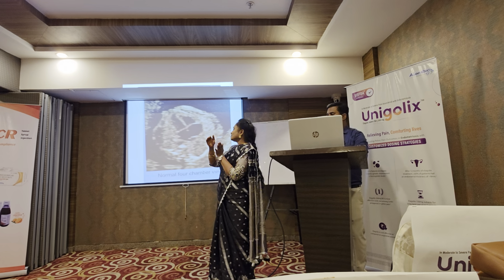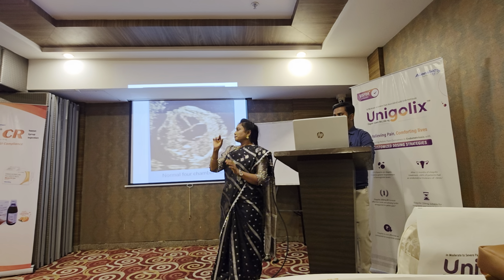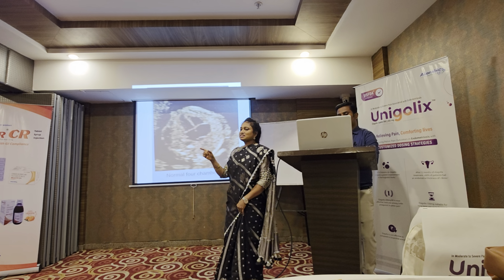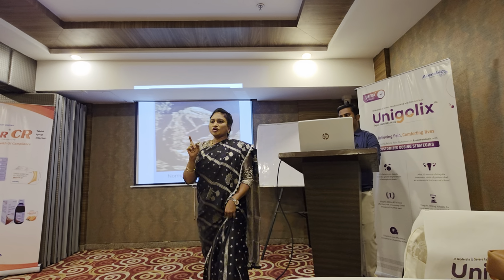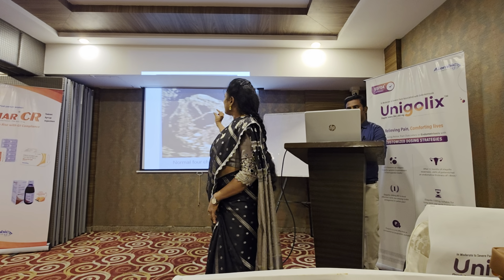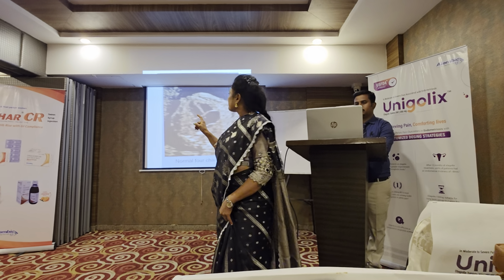Between the aorta and the left atrium, there should not be any gap. If there is a little bit, say more than 5 mm gap, it means there is venous anomaly of the heart. So that is very important. It's a very small point, but if you see that, it means that there is some venous anomaly.